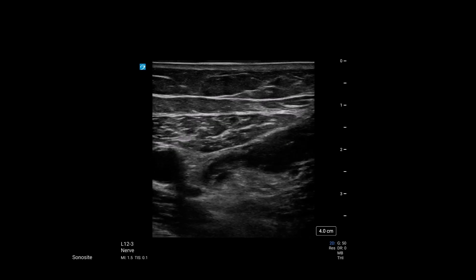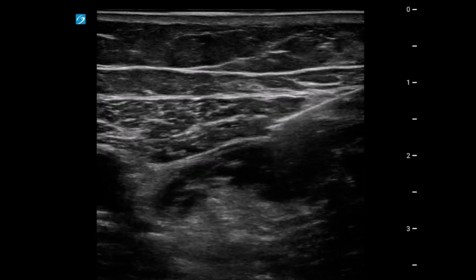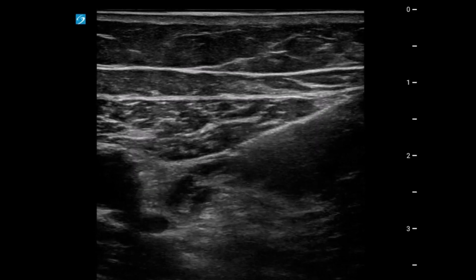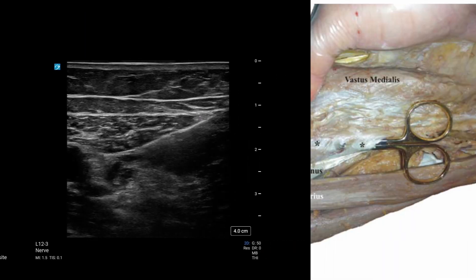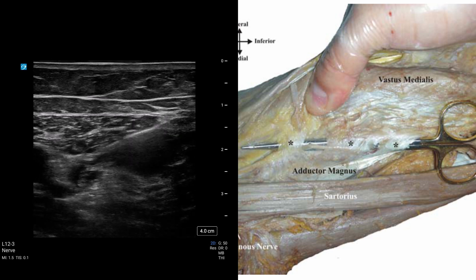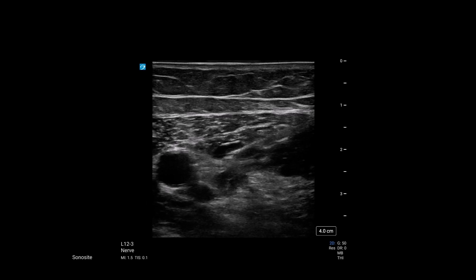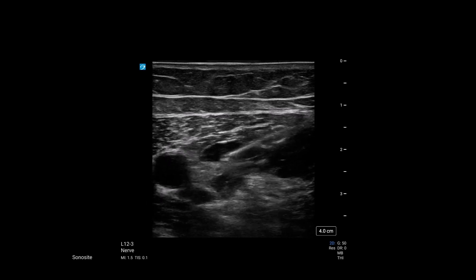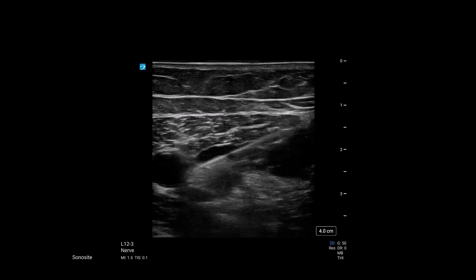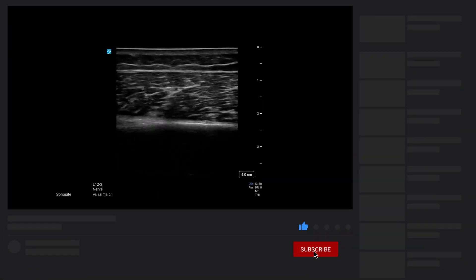So we're going to come back — I've got a sense there's a sliver of darkness there which is what I'm going to try and aim for, to open that up. If you want to sound smart, you may have a time to talk about the vastoadductor membrane — it becomes a bit more prominent further down the leg. A little injection — not doing what I want, so we'll pop in. What that's doing is lifting muscle off the fascia, kind of like a rectus sheath block, so again that's not the spread you want. So I'm going to pop in here next to the artery. Nerve somewhere here — little pop, little local — there we go. Now you can see a beautiful nerve there, and now we've got nerve to vastus medialis identified.